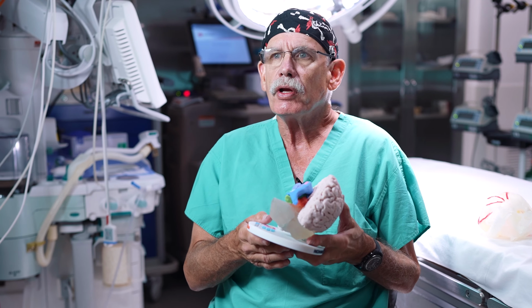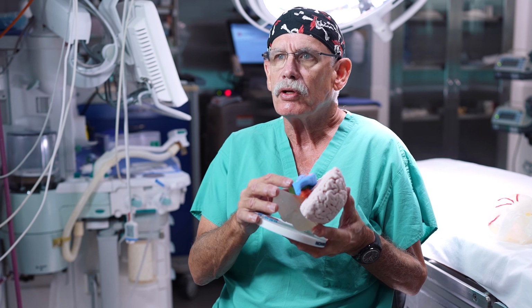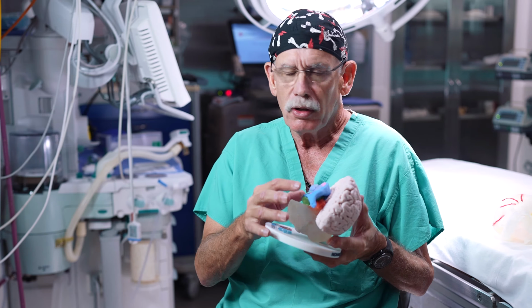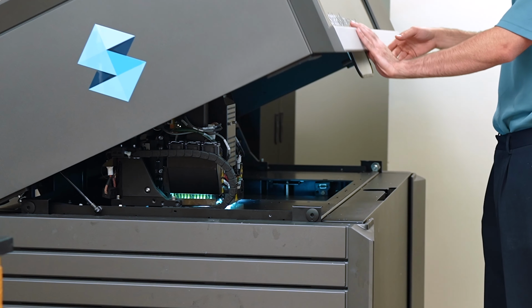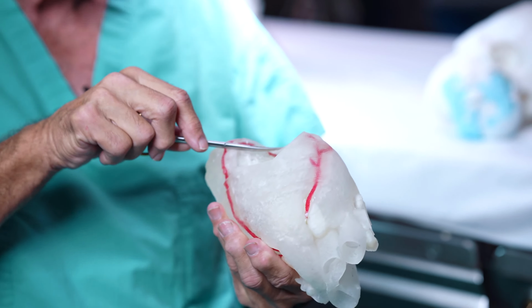So in 2016, we upgraded from single color, single material to the Stratasys J750, a $500,000 instrument that allows us to print multiple colors, multiple materials at the same time, that enables surgical planning, enables patient and parent education. Again, through the charitable donations and the support of the foundations, we were able to upgrade the J750 with the digital anatomy module that allows us to cut and sew and actually practice operations on the exact patient's anatomy.